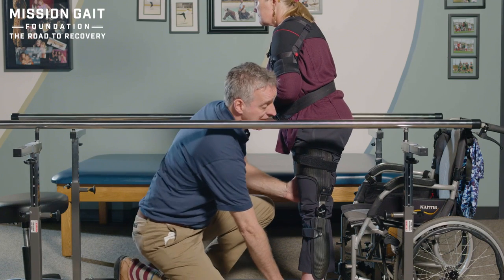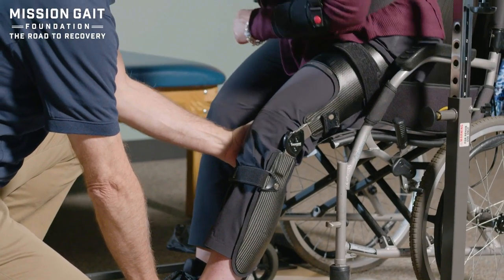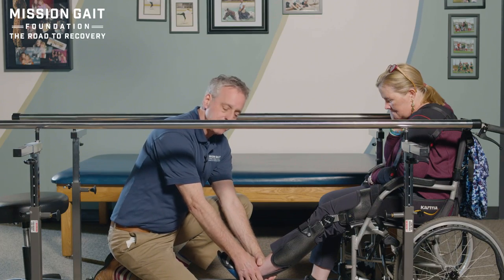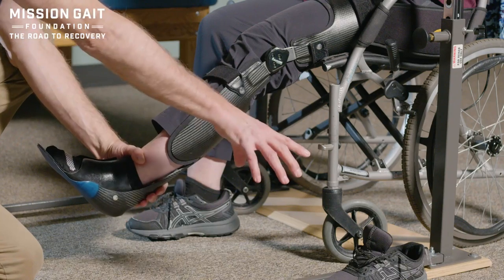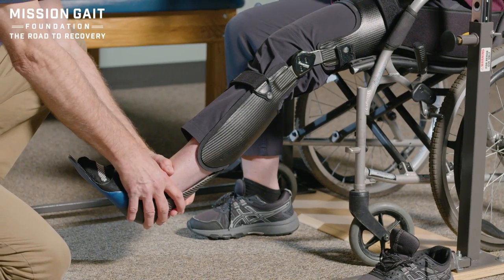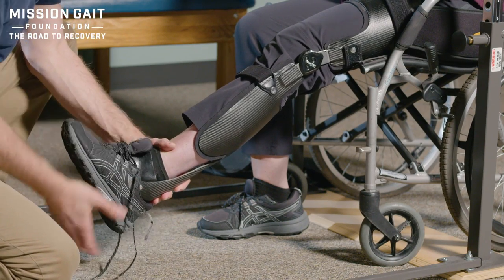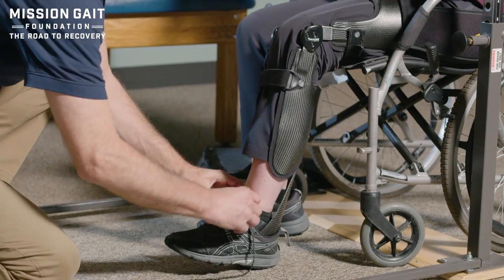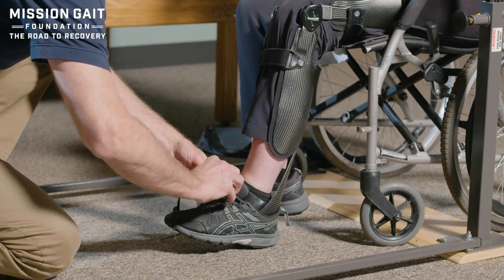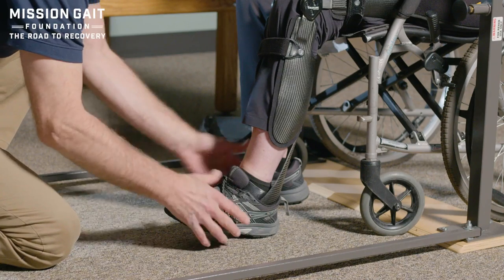Eleanor, it looks good, so I'm going to have you go ahead and sit down. I'm going to slide the leg out since we're not in a shoe and let you sit right back into the chair. This brace did have a strap for the foot to hold it back into place, but that strap was very difficult for her to get on. With a good shoe with a good lace-up, a lot of times you don't need that strap — the shoe will hold the brace back in place. So you can check that with each patient. Make sure the vamp is wide open on the shoe, slide all the way up in, take up the slack, and simply make sure we've got a good fit holding her back into the brace. I want a double knot so that it doesn't come loose.